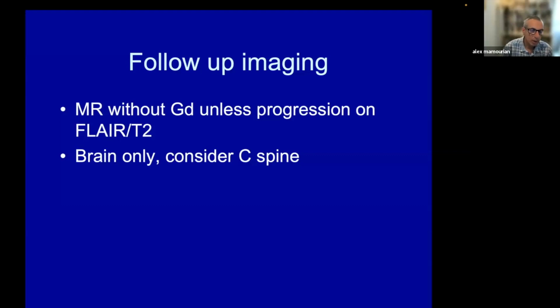Now, in terms of follow-up, it is the opinion of myself and many others that gadolinium is not necessary on every single follow-up scan. These are frequently young patients who are going to have regular imaging over the course of their lifetime. And there is some lingering thoughts about whether gadolinium is entirely safe in terms of repeated dosing, because we see the vestiges of the gadolinium on MR imaging. So personally, I think I would prefer to avoid gadolinium if possible.